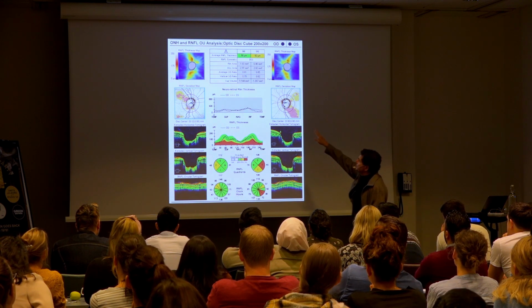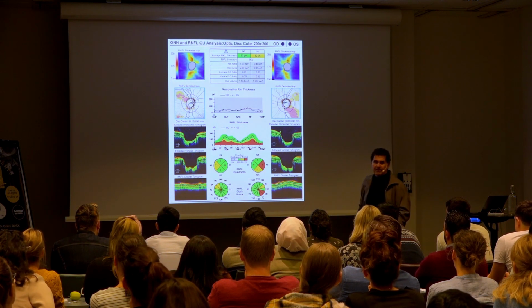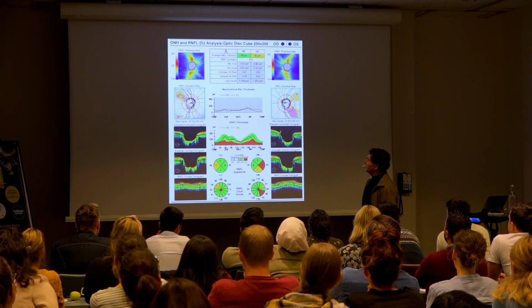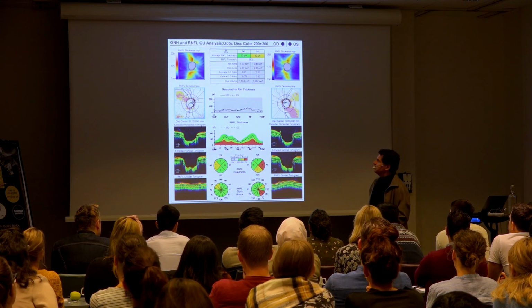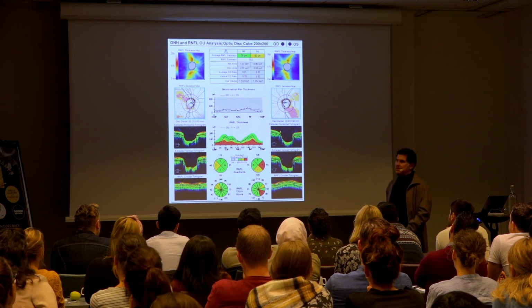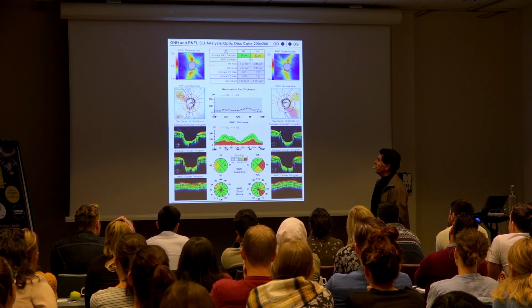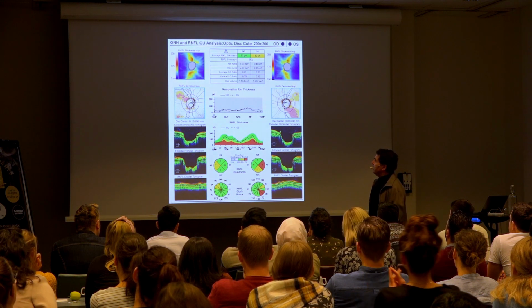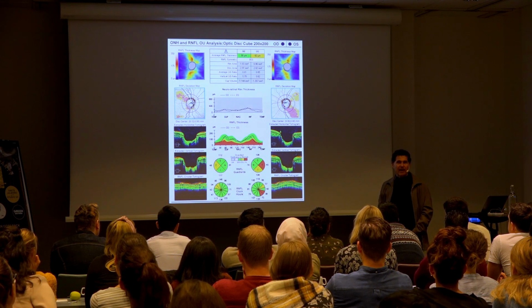Do you know why, on that disc analysis, the reports make it gray? Do you notice it's gray there, instead of green or yellow or red? There's a reason why they make it gray. That means that the disc area is outside of the normal range, and so all of the parameters for cupping can't be used. That disc area is almost 3 millimeters squared. Normal is about 1.75.